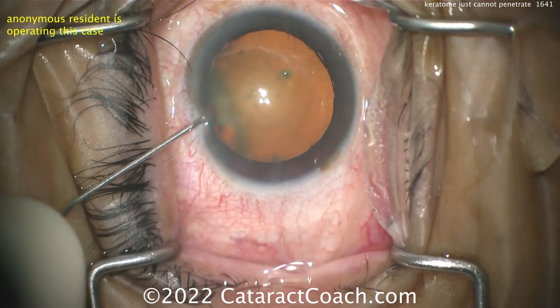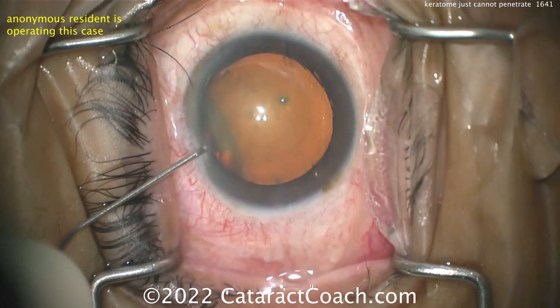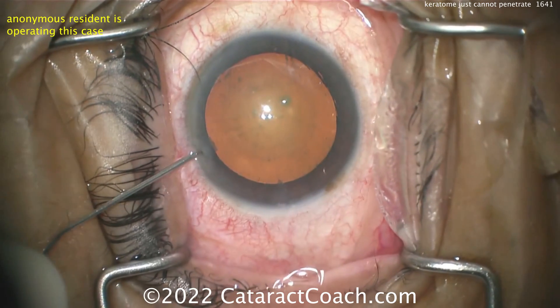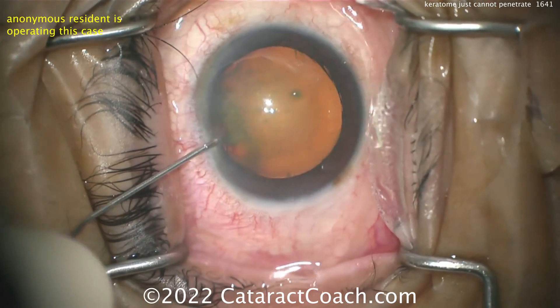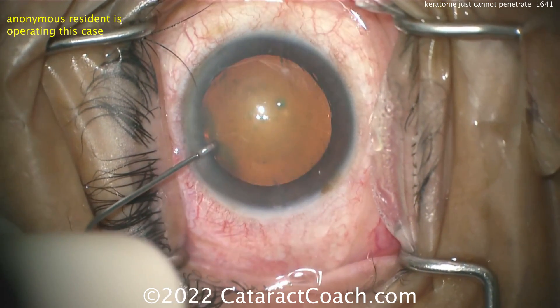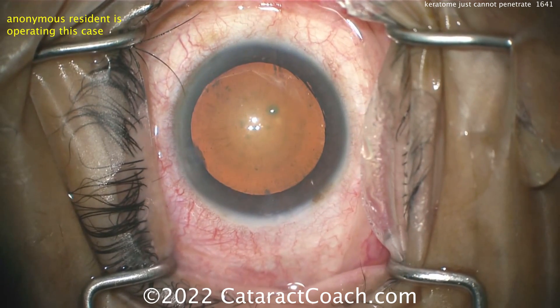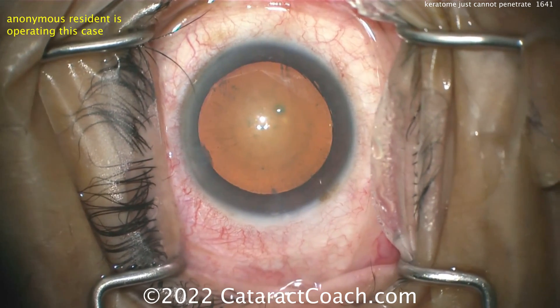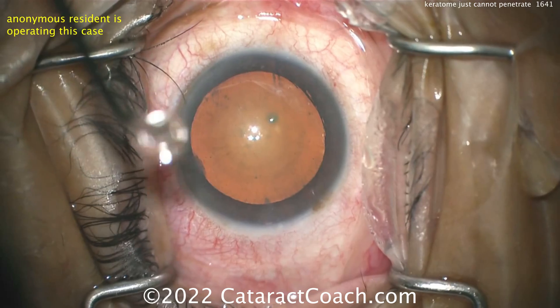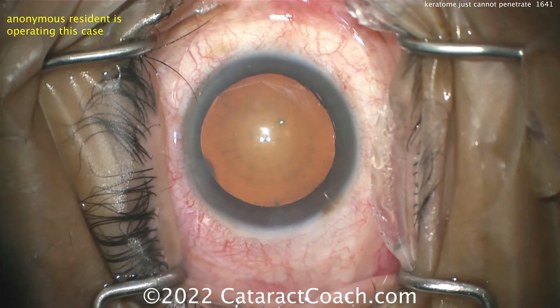It looks like the young doctor's called for a replacement keratome to be opened. Replacement keratome coming up. In the meantime, maybe putting some more viscoelastic in the eye. Just kind of poking around at it. Draping's pretty good — a couple of lashes there at the top of your screen that are out of the drapes, but we'll forgive that. If you do have that situation with a couple of lashes, just cut them off with the drape scissors, then wash off the surface of the eye.